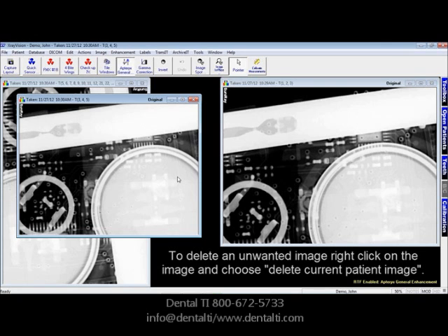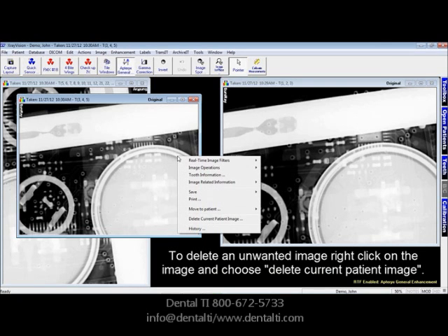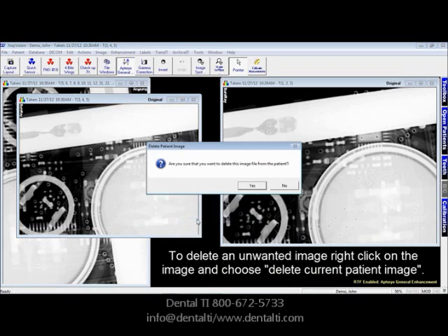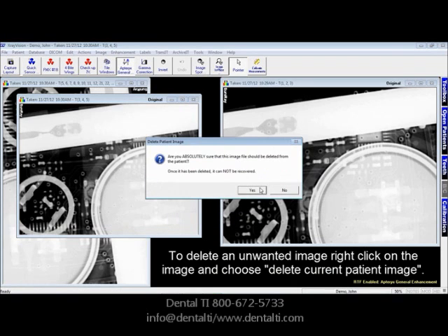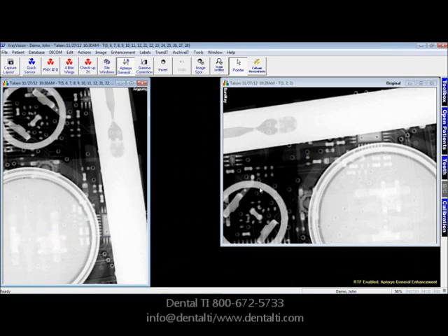To delete an image, right-click, go to Delete Current Patient Image, click Yes — and it will ask you twice. That way you're not deleting images by accident. That's a lesson on single image capture.